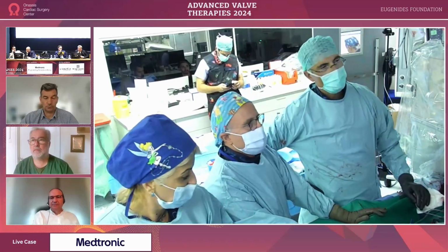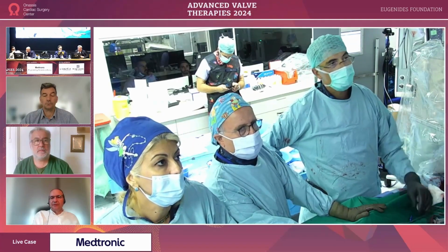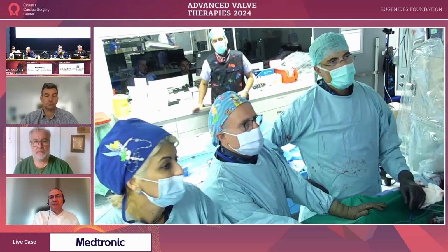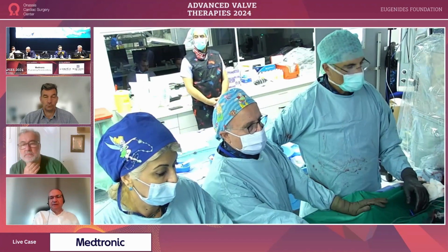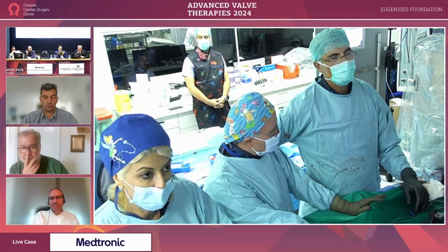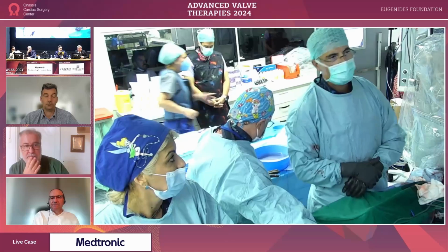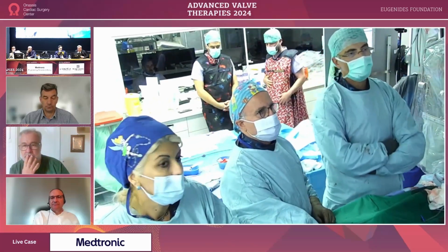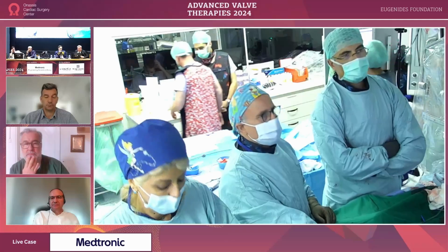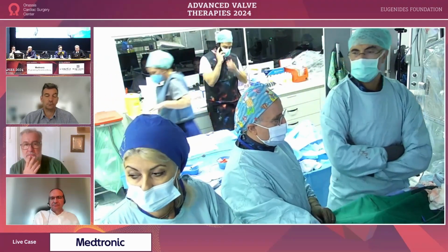I believe in that. When you post-dilate, you always risk the... No, pre-dilatation. Yeah, the pre-dilatation, yes. The pre-dilatation would stabilize most of the times we do it, but when we anticipate an easy implantation, maybe 20% of the cases, as in this case, we don't do it. But this is by trial and error. So in hindsight, maybe we should have done pre-dilatation.